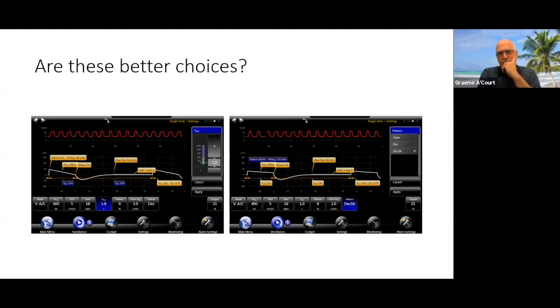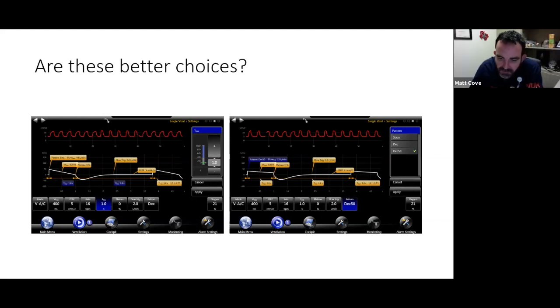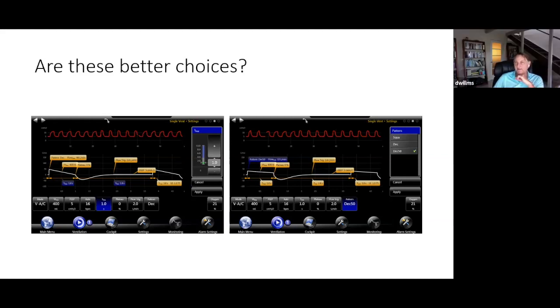Yeah. Well, how does it guarantee the targeted tidal volume then? Because based on the patient's physiology, getting down to that 50% flow, you may or may not achieve your tidal volume, right? Yeah, of course. Because your tidal volume is still a flow controller, right? It still controls flow to deliver volume. It just really, like Steve said, that halfway through the breath the flow is decelerating to 50%. PRVC. It's not stopping. It's just decelerating.